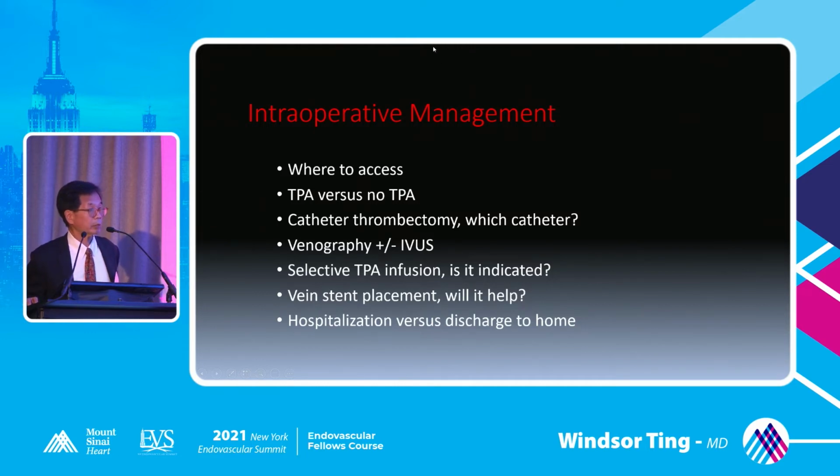What about stent placement? It's very important in these cases, by the time you're done, to have good inflow and good outflow. So in some of these patients, stent placement will be very helpful. And finally, whether I'm going to hospitalize the patient or discharge the patient. In many of these cases, I have discharged the patient right after the procedure. Not every case, but many of these routine DVTs have become really routine, and I feel quite comfortable sending the patient home right after the procedure.